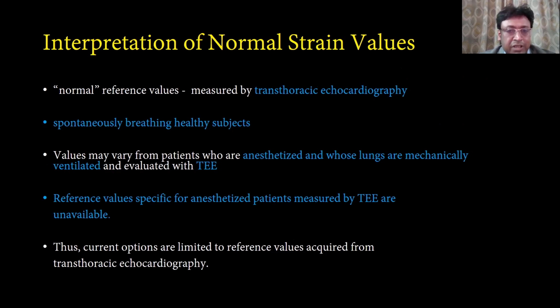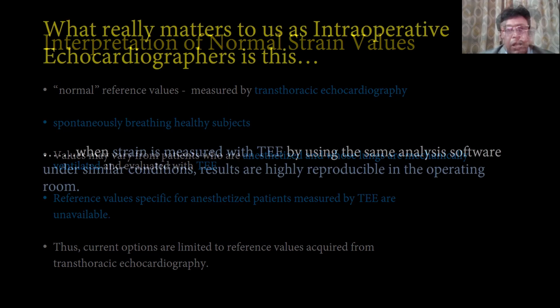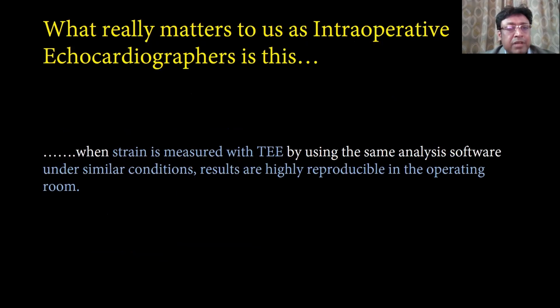And our assessment in the OR using TEE is on anesthetized patients whose lungs are mechanically ventilated. So the values would be different. And it is important to note that when strain is measured with TEE using the same analysis software under similar conditions, results are highly reproducible in the operating room.